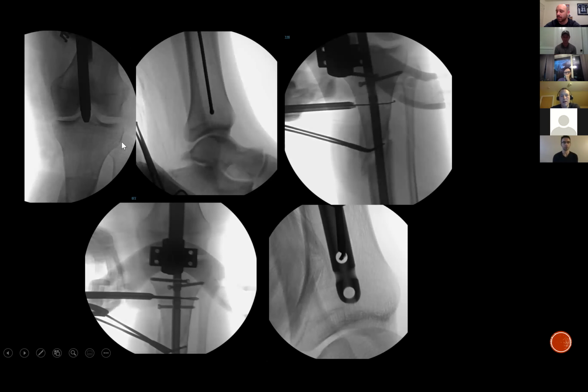This is not quite a perfect x-ray. You can see there's not enough fibular head overlap. So we're actually a little internally rotated here. If we externally rotate it a little bit, we get more fibular head overlap, and you would see that this start point was actually right on that medial slope. We've placed our ball tip guide wire right down to the center of the plafond.